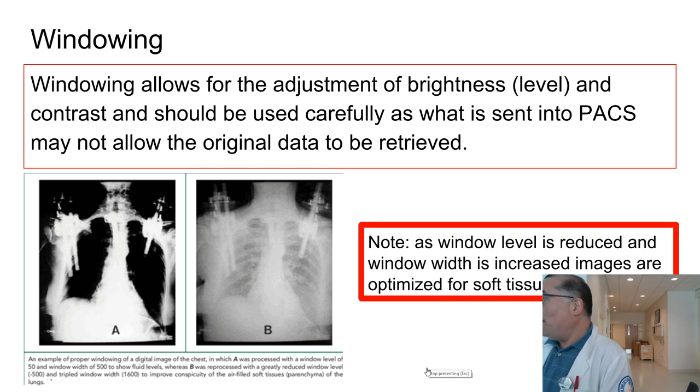But are you getting the hint that this means extensive memory use? Right. We're no longer talking about megabytes. We're not talking about gigabytes. We're not talking about terabytes, which might be your external hard drives that you buy to keep your movies on. We're probably talking about petabytes, which is like the next level. So it gets expensive for a hospital.